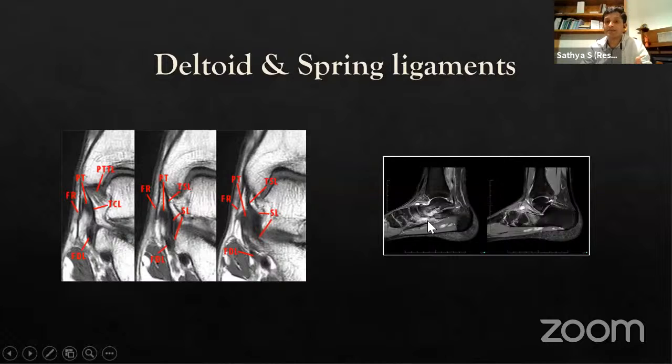Here we are able to see a spring ligament involvement, and this is one of my patients who heavily landed on their foot, and they completely injured their spring ligament because of the pain. We thought that they had developed plantar fasciitis. Here we can see a thin line at the bottom of every other muscle, and we are seeing that that's the plantar fascia. The rest is all the fat pad that is present along the heel area.